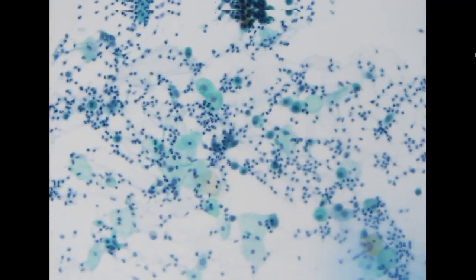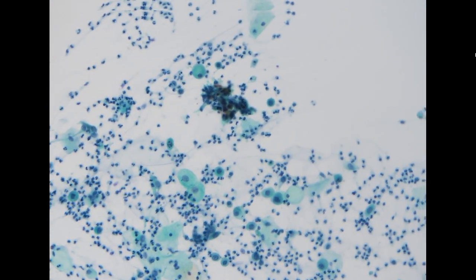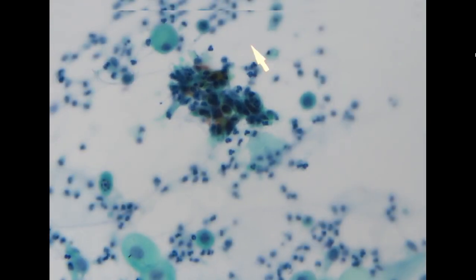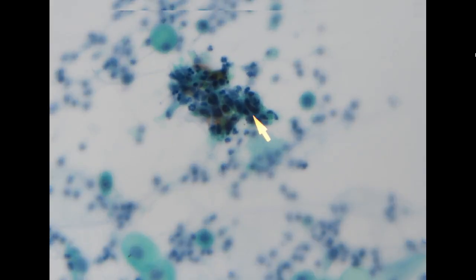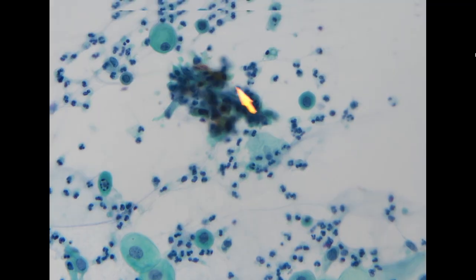In this specimen, we start to identify a few clusters showing degenerative features, but with increased NC ratio and dark staining nuclei. Due to the degeneration, you won't be able to see the chromatin pattern very clearly.